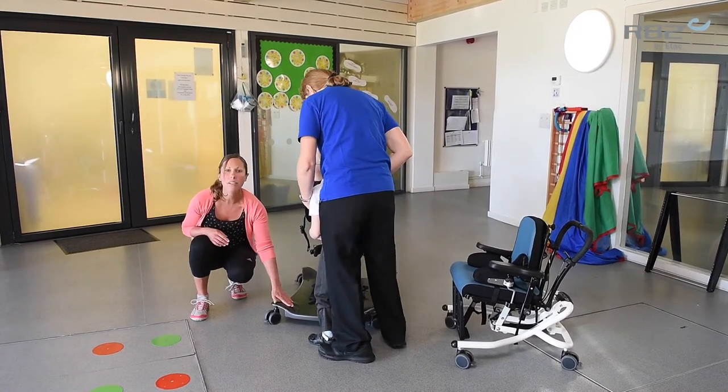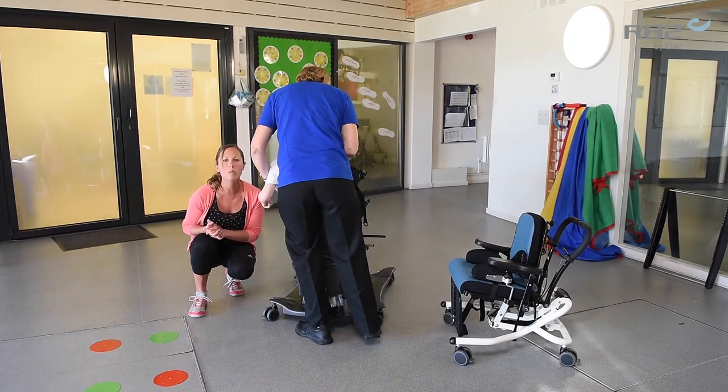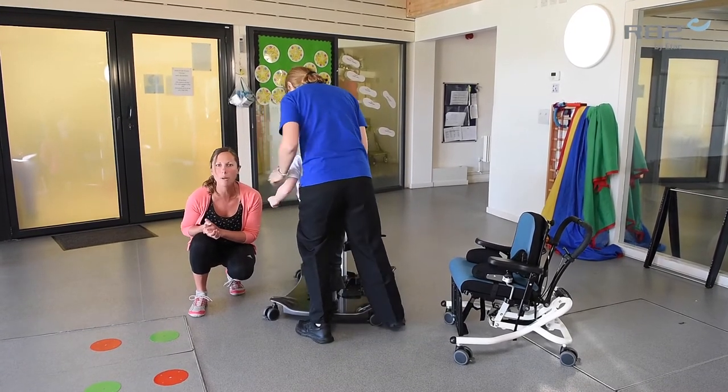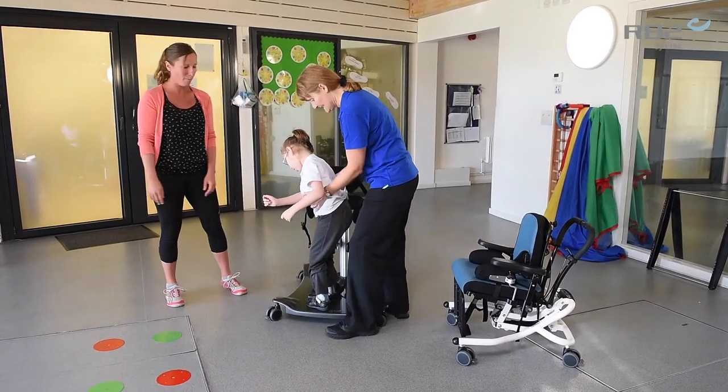And because it's so low, it facilitates a nice easy step without any lifting. We can keep those normal stepping movements and that development programme going as we go into the Meerkat standard. So it's another element of the therapy she can be working on.